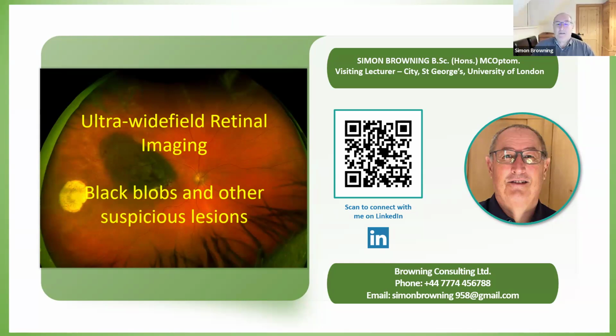So, first two lectures, we looked at why ultra wide field, and then all about autofluorescent imaging and how that helps us with our diagnosis. As I said before, these first few leading up to June are really lecture sessions where I'm trying to introduce you to a lot of the things that we see with ultra wide imaging and what's on the retina.